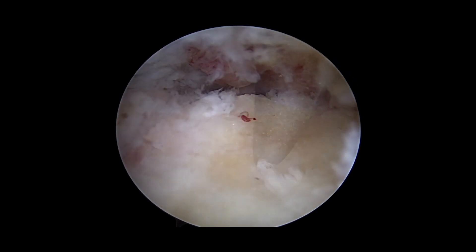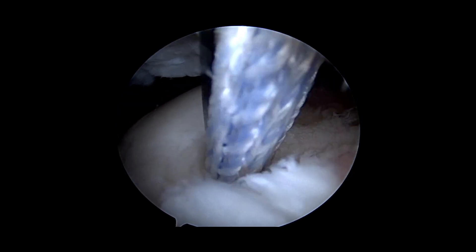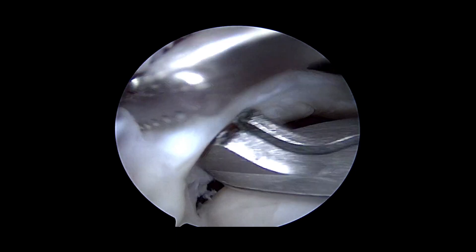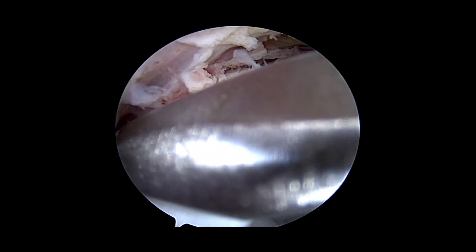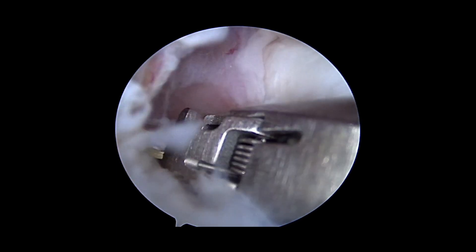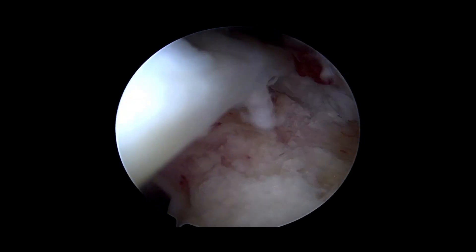Having prepared the footprint, we're going to put in our first posterior anchor at the posterior edge. This is a swivel lock which is loaded with blue fibre tape. Having screwed that into position, we're going to load the splice tape into our scorpion. We can see we can take up both delaminated parts to get a nice pull. We pull that back and then deploy the suture. The tapes have been passed and pulled through for a nice pull.